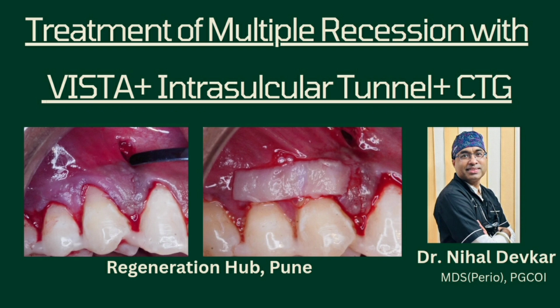In the first part of this video, I'll walk you through the surgical options available for treating MAGR, an introduction to the intrasulcular tunnel and VISTA approach, the basic principles of VISTA along with its advantages, indications and limitations, certain modifications, and a brief overview of scientific literature supporting the success of these techniques.